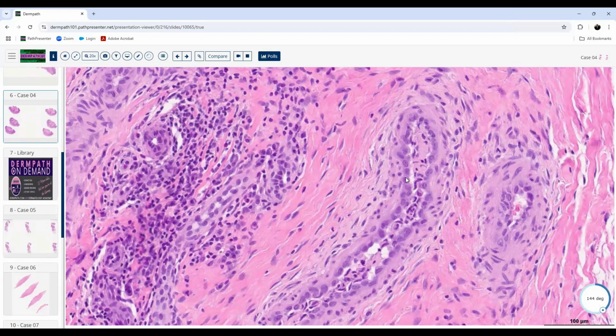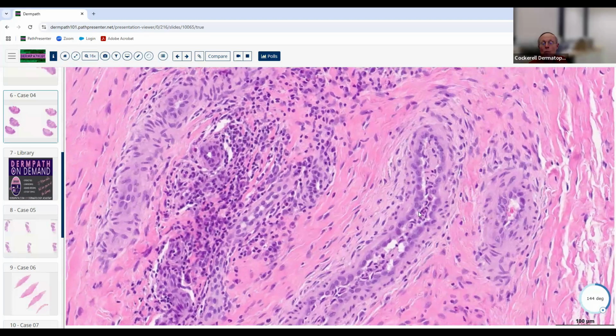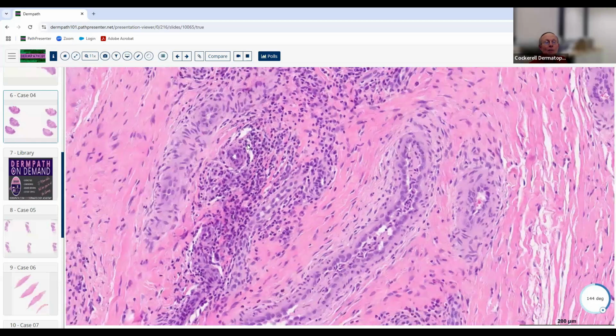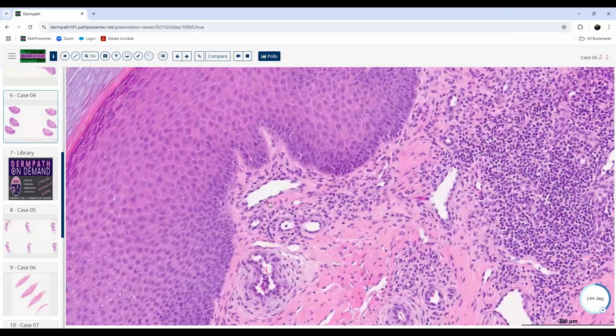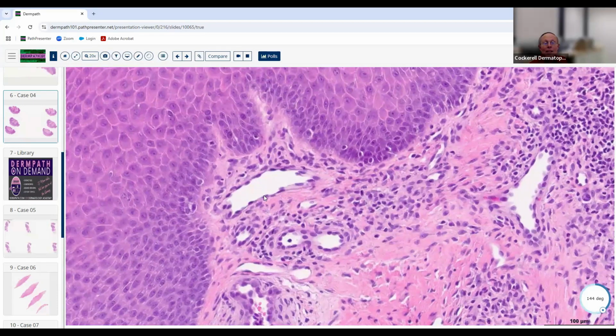They're lining up nicely. They're kind of plump, as expected. On a scale of 1 to 10, these guys need some big time Wegovy. They're really large and plump and protruding into the lumen, which is not normally what we see in regular endothelial cells, is it? If we look at this normal capillary up here, look how thin and flat those endothelial cells are.